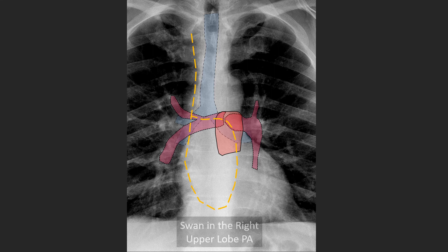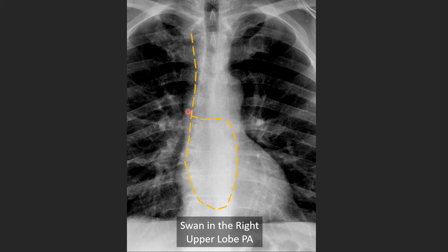Here's a catheter entering the right upper lobe pulmonary artery. Using the right main stem bronchus as the cutoff, we can see that the catheter begins to slightly upslope towards the upper lobe pulmonary artery.